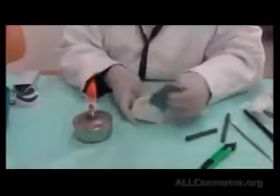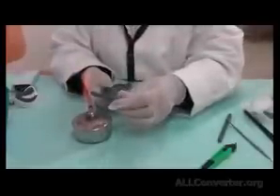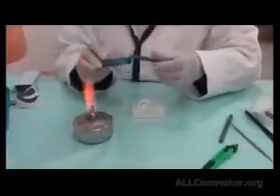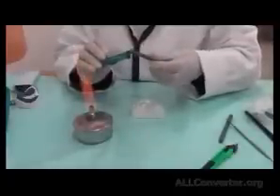The way you are adding green stick to the posterior area would be the same up to the hamular area, but then we're going to add also on the fitting surface. We'll be telling you why in a moment. So I'm going to do my regular additions on the distobuccal angle of the upper. Stop sticking, I stop adding. How do I know it stops sticking? I keep pulling it away from the tray. So it's still sticking. But notice here, I'm putting it and taking it away and it's going out. It's not sticking, see? Even if it's still flowable and workable, it's not sticking.